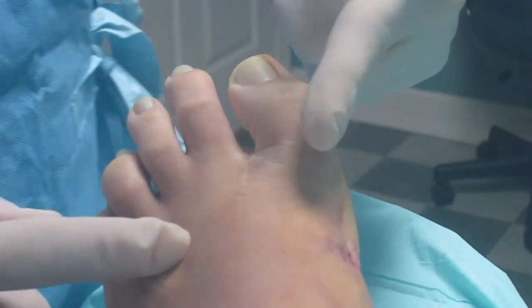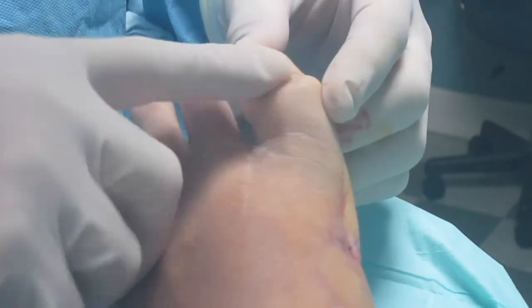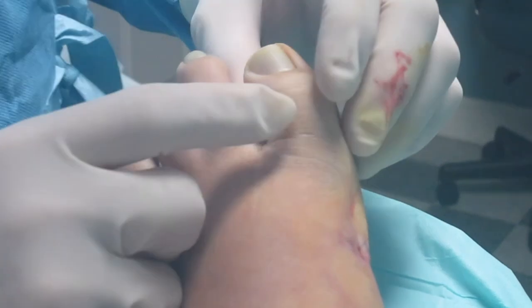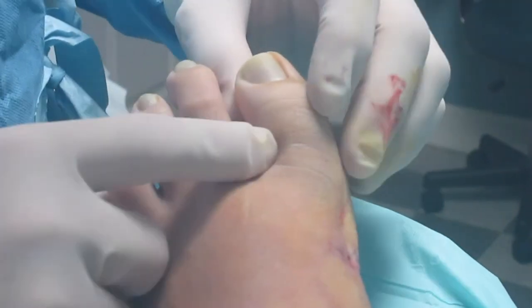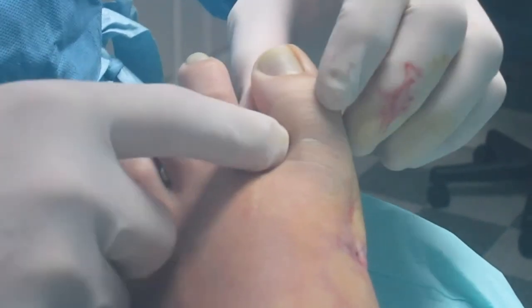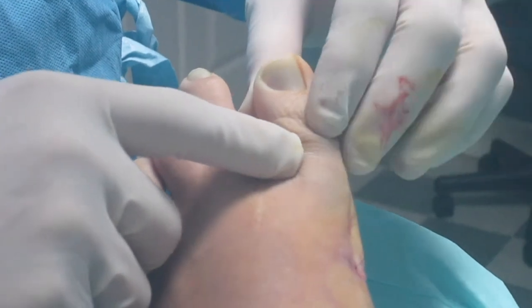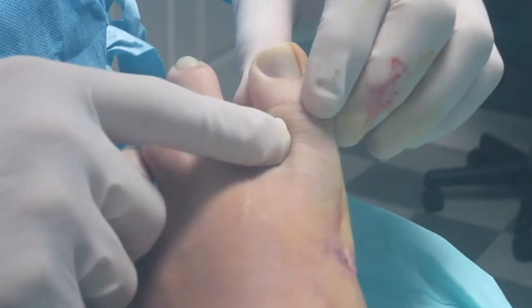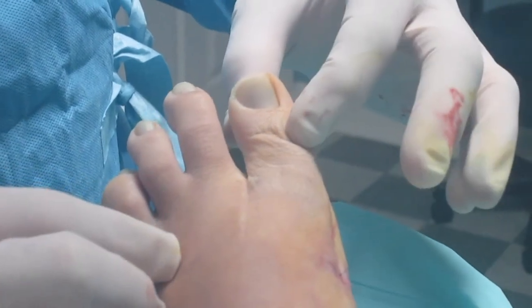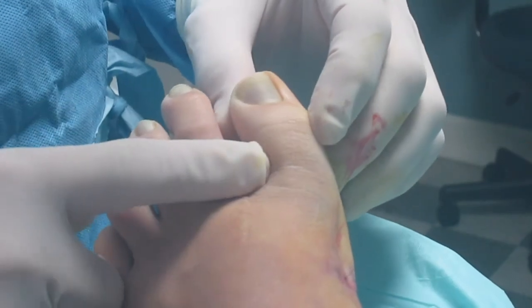You can see her toe is still out a little bit medial. And a lot of these people get a little hammer toe in the hallux as well. The way we're going to treat that is that we're actually going to cut this in two planes. We're going to move her toe over. We're going to also move this part up. So we'll take a little bit of a wedge from the dorsal aspect of this toe and pull that down. So we'll straighten this toe out like that. And that way with minimally invasive surgery, we can do more 3D type of corrections.